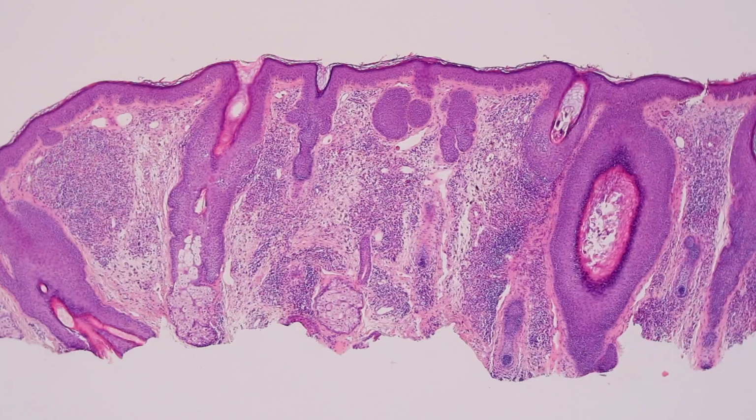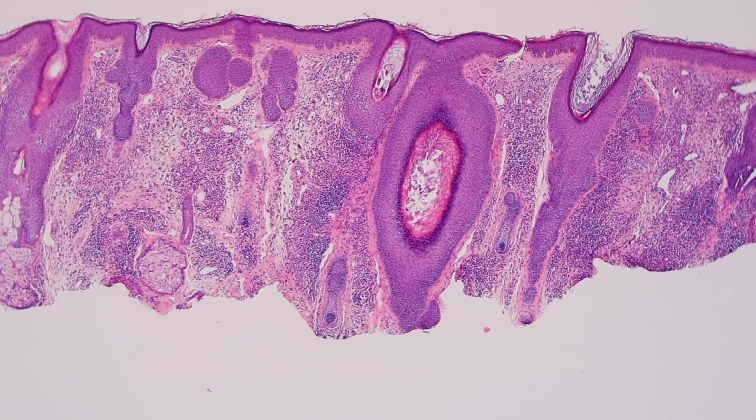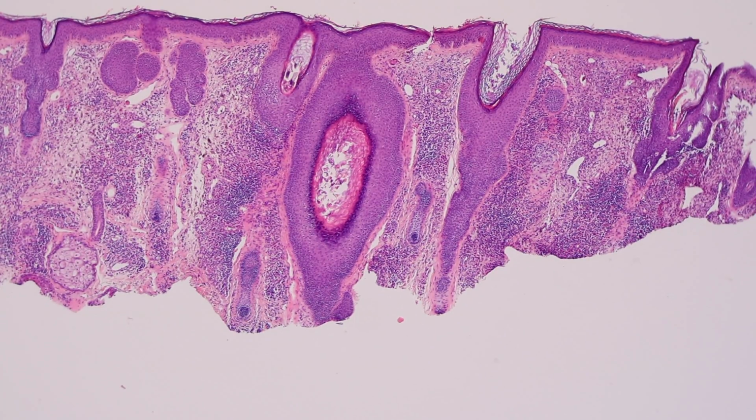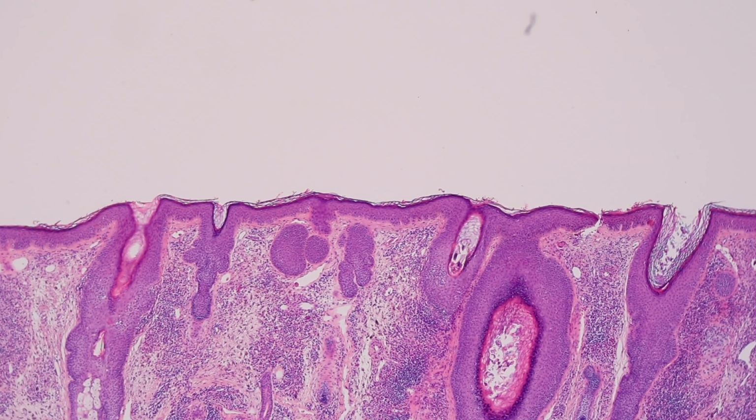Now this is a really fun entity that I really like. This is a shave biopsy of a violaceous plaque on the face of an adult. And you can see the dermis has a lot of inflammation. Basically, the whole dermis is packed full of inflammation, but the epidermis is totally spared. There's no inflammation or really any change of the epidermis. And there's a little zone of relatively normal dermis between the inflammation and the epidermis.